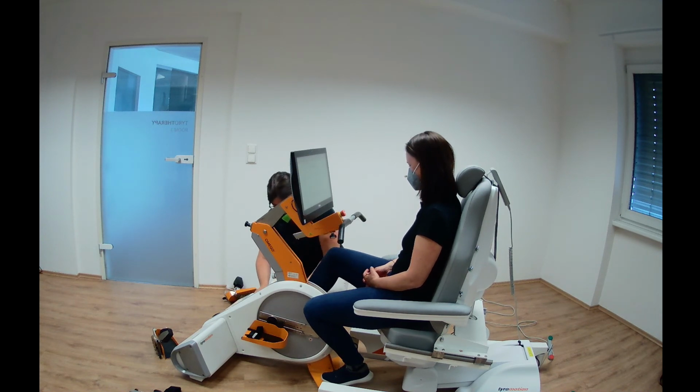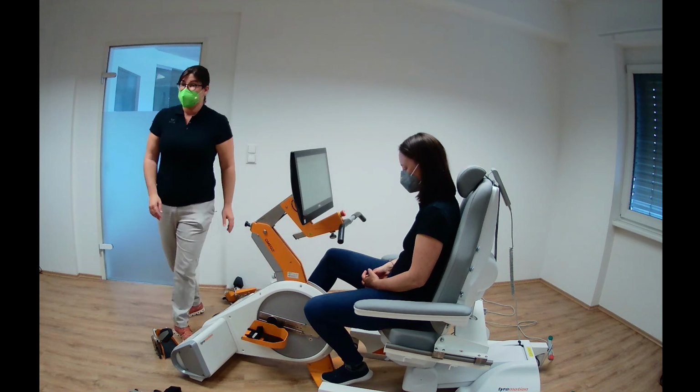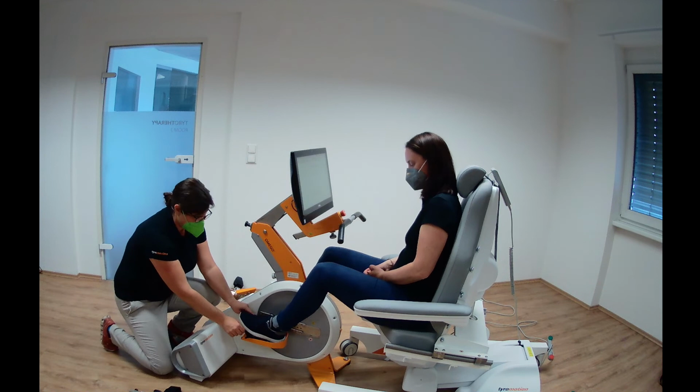All right, why do we have to change the footrests? Because here we have a magnetic coupling now. That means that the patient is really safe in this position, and even if the machine would do a movement we don't expect, nothing can happen.